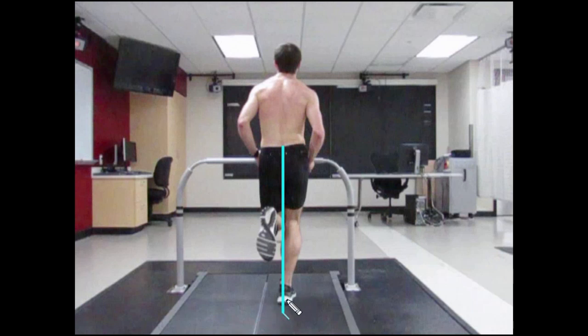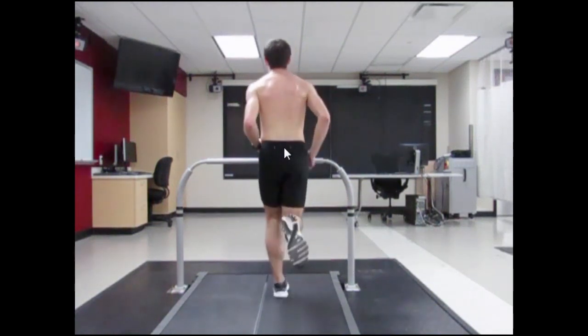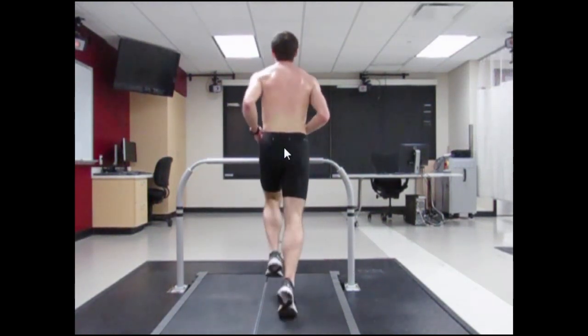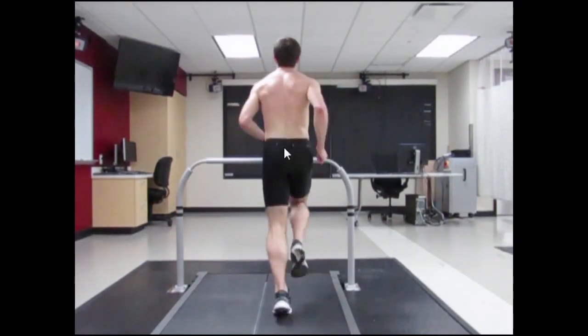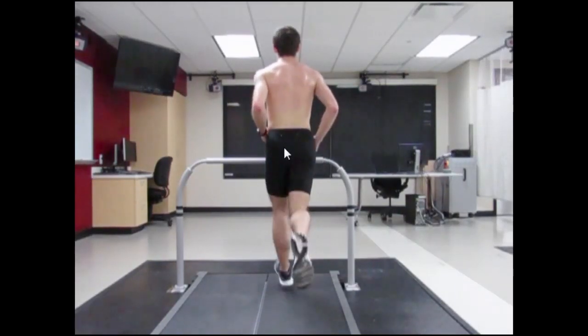Because of this fairly narrow position of the foot with respect to the center of mass, there is very little medial lateral displacement of the person's center of mass during running. So again, if we hold our arrow on this spot, the individual may drift a little bit side to side in the treadmill belt, but you'll notice that his position, medial lateral displacement of his center of mass, is minimal.